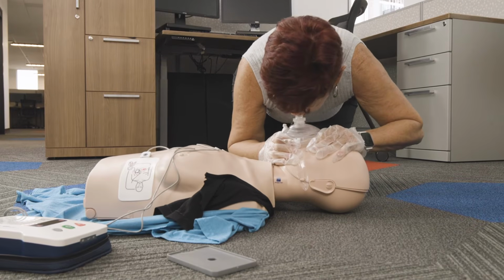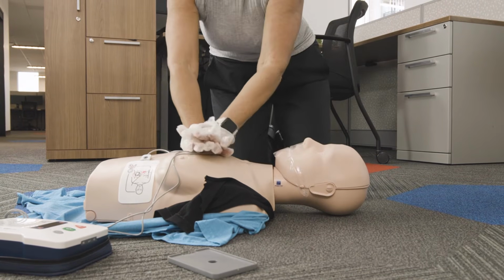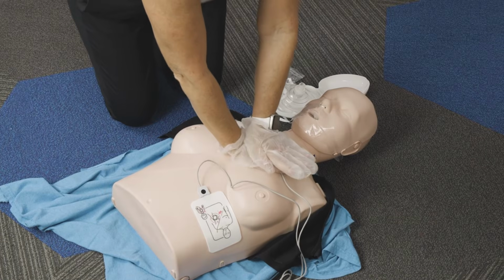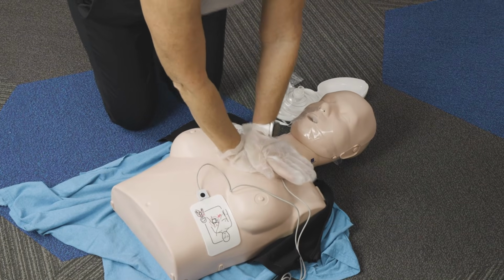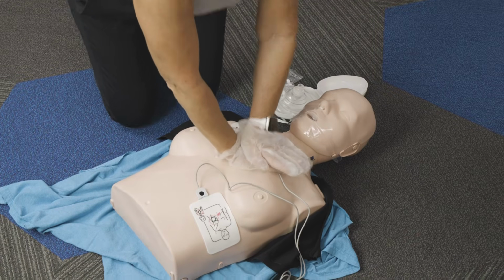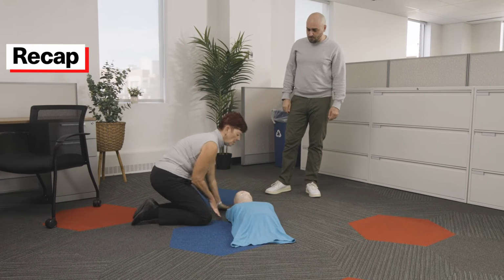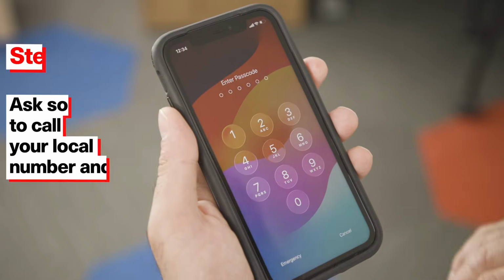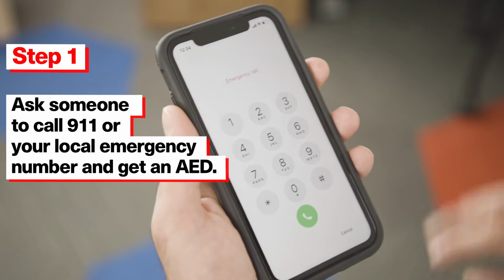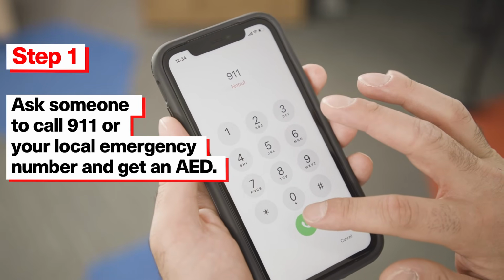CPR or cardiopulmonary resuscitation can save a person's life if they are in cardiac arrest. CPR keeps blood and the oxygen in it moving through the person's body until advanced medical help gets there. As a reminder, the basic steps you should take if a person is unresponsive and not breathing are: Step 1. Ask someone to call 911 or your local emergency number and get an AED.